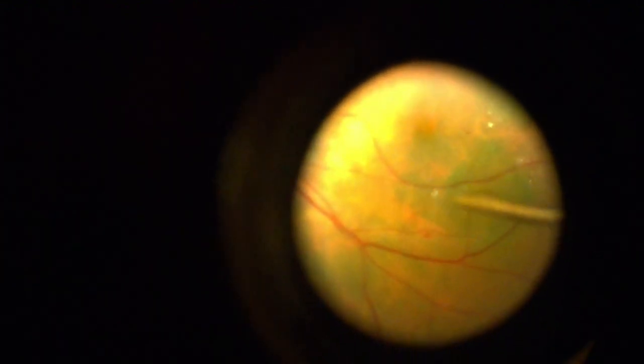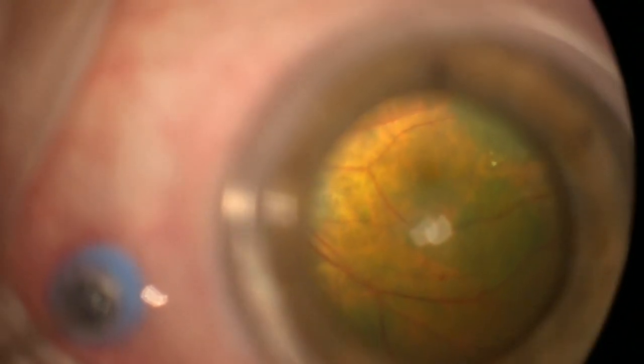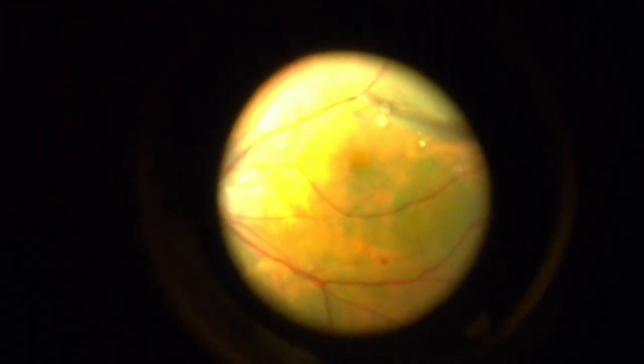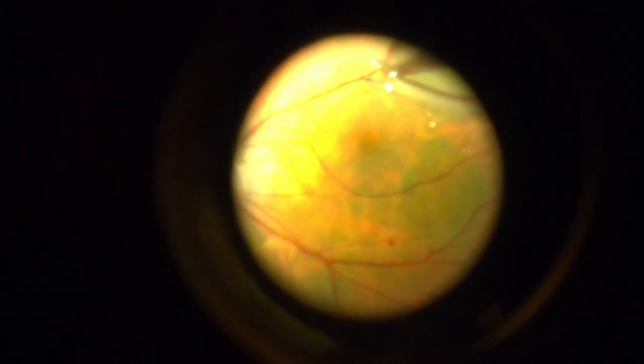And you can use this loop scraper if you wanted to, going all the way around and just scrape, scrape, scrape your way around, trying to avoid any direct trauma to the central macula, of course. We're not going to demonstrate that. I'm going to go with my forceps here, which is a 25 gauge reusable forceps. Now, a lot of forceps are disposable, and that can be a bit of a cost issue. So depending where you're working or your cost sensitivity, reusable can be a nice option if you can preserve the tips and not have a lot of damage.